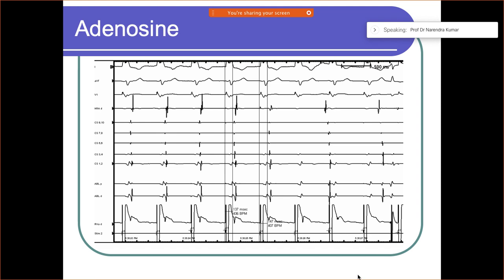You are able to notice the A as well, VA, VA. And then later on, when you're pacing, there's no A over here. There's no A over here. Later on, the A starts. So a lot of times for the accessory pathway, whenever you're trying to do this, otherwise, I have had more than 10 papers about the usage of adenosine after AF ablation for seeing the dormant reconduction.